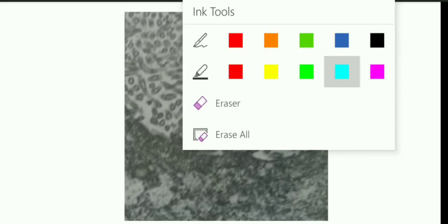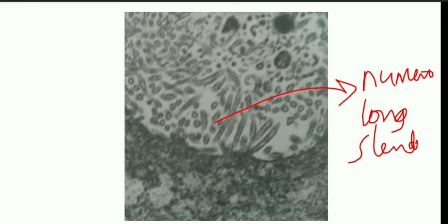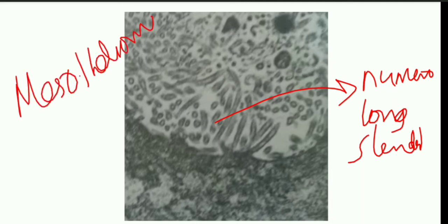Next, when you look at the other picture, this is also an electron microscopic picture, but here you can see there are many microvilli - numerous, and they are long and slender. Numerous microvilli and tonofilaments - their presence in electron microscopy suggests mesothelioma. So this is a mesothelioma electron microscopic picture.